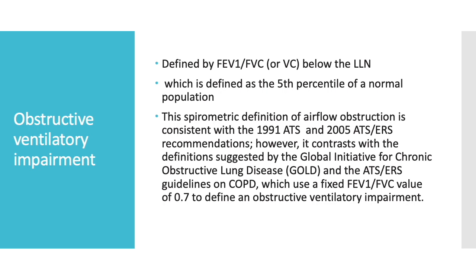So it is to be remembered that for interpreting any patient's report, a pulmonary function test is not diagnostic of a disease but of the physiology. When you are trying to diagnose COPD and you've ruled out all the other factors and assess the severity according to the GOLD guidelines, you could use the pulmonary function test report values to interpret the GOLD severity, but in no way will a lung function testing report be indicative of the diagnosis, rather it will be of the physiology.